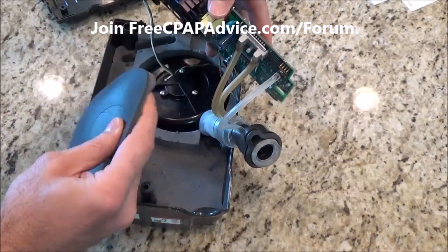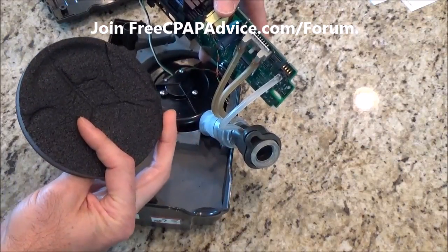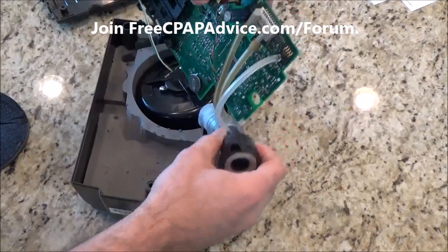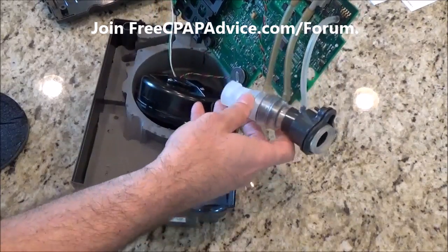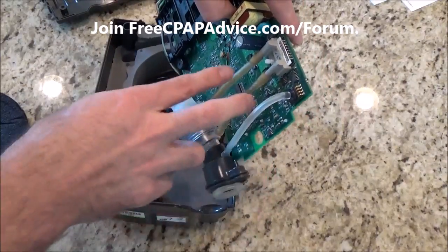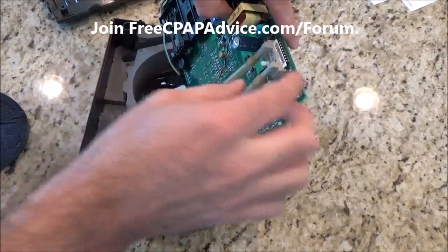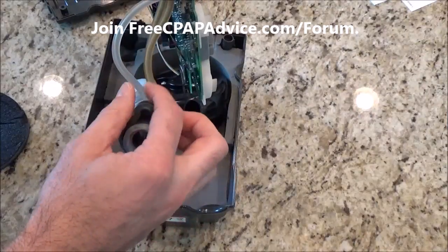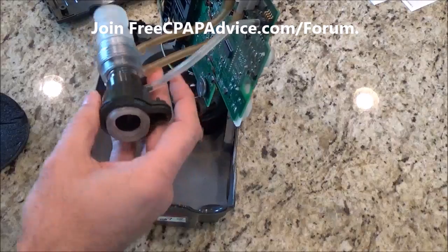This looks like just padding to separate it from this, give it a little extra protection, and probably noise buffering. This thing right here looks exactly like a pneumotac. If I pull that off, this is the fan. This is like a pneumotac. This piece here is telling the machine, the circuitry here, what the pressure is, probably what the leak rate is as well. I don't know, there's 3 tubes going in there. I don't know what they all do. But that's pretty cool.